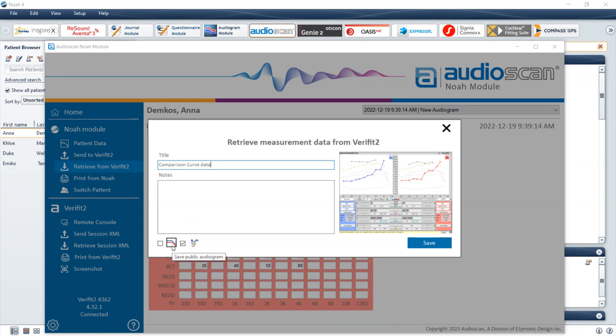To save the current audiometric data privately so that it is only accessible from within the AudioScan NOAA module, uncheck the box beside the audiogram icon in the bottom left of the window. If RECD is being retrieved from the AudioScan equipment into NOAA, the Save as Public RECD icon will be selectable. Check this box to share this RECD data with the entire NOAA 4 database, making the RECD accessible to other NOAA modules such as hearing aid manufacturer NOAA modules.